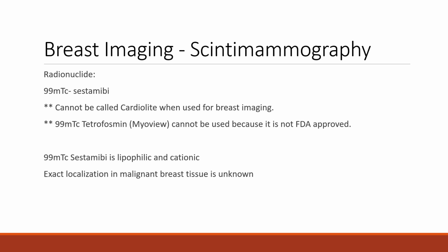have the potential to do really great things, especially if you're doing solid state imaging and you're not using a regular PM tube gamma camera. Then you can really get great pictures that are pretty much as good or better than mammography.